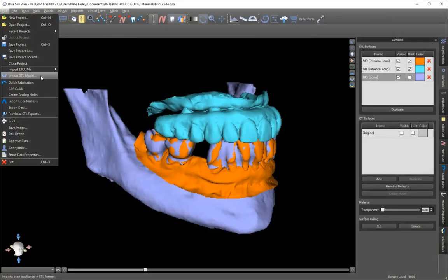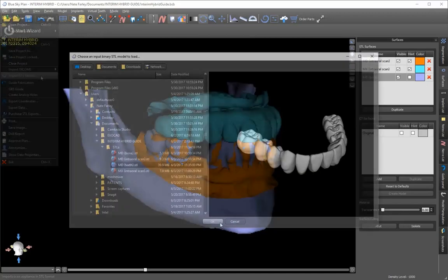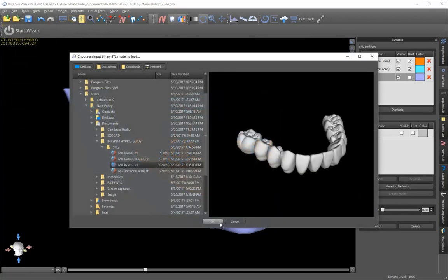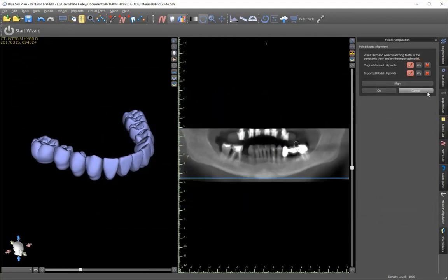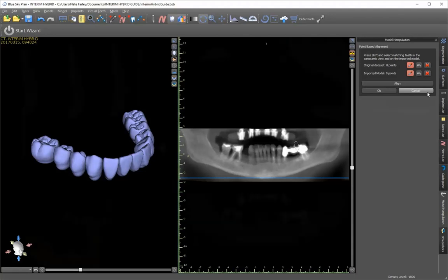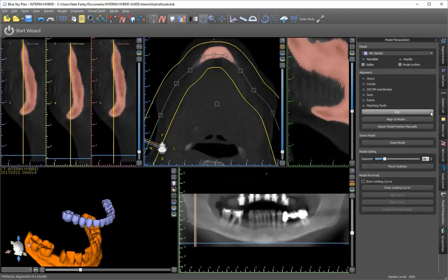And then when you go back over into Blue Sky, we can say we want to import STL models. Choose those teeth from the folder. And when you bring them in, it always again defaults to this screen right here. You just want to hit cancel.